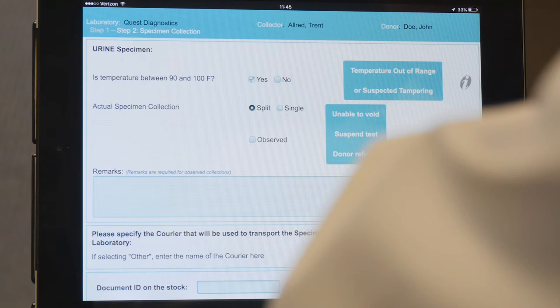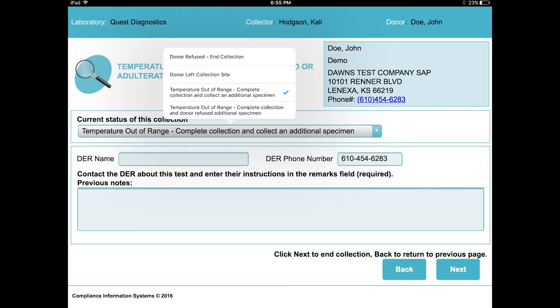If the temperature is in range and you do not suspect tampering, you can proceed to the next line. If you tap No for temperature range, or you tapped Yes but still suspect tampering, tap the new button to the right which says Temperature, Out of Range, or Suspected Tampering. Under the heading Current Status of this collection, tap the down arrow on the right-hand side to see the full list, then select the reason for concern. This step also requires calling the designated employer representative, the DER. The DER contact name and DER phone number should be visible so that the collector can contact the DER. After contacting the DER, the collector should note the DER's instructions in the Remarks field and click Next.